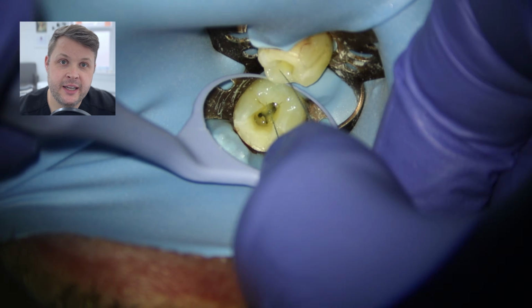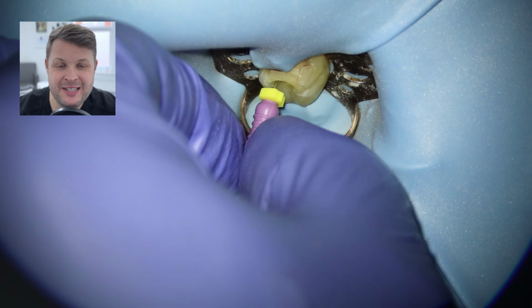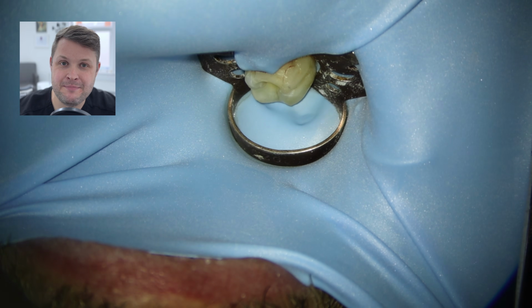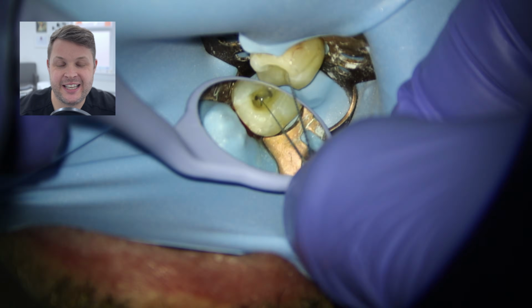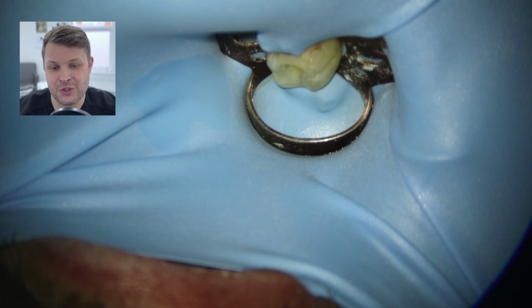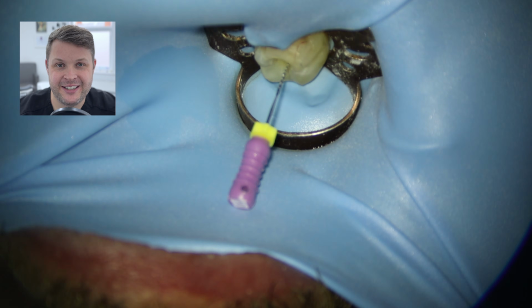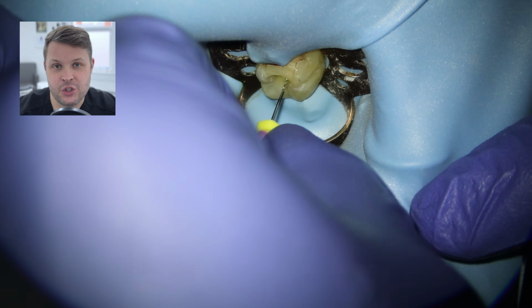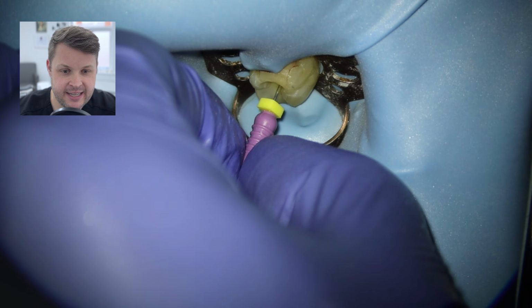We're then going to try and get down the mesiobuccal canal, and you can see here that I'm struggling a little bit. I always feel like the mesiobuccal canal is usually the canal that the patient has to open really wide for you, because it's just always a little bit difficult to squeeze the file in there. But eventually I get it in, and then I'm just going to do that nice watch winding motion with the size 10K file.